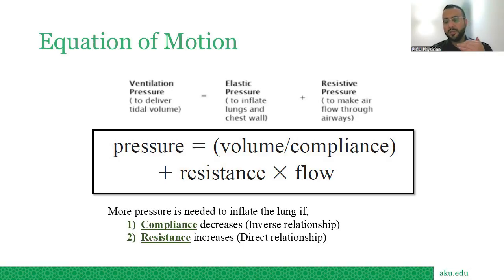Okay, so the lower the compliance, the more effort is needed by the machine. The higher the resistance, the more effort is needed by the machine.